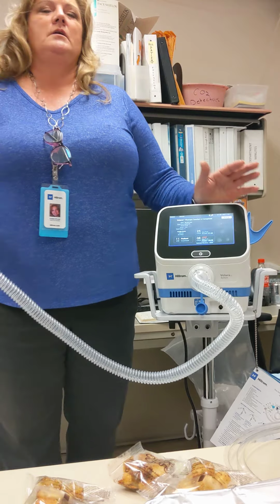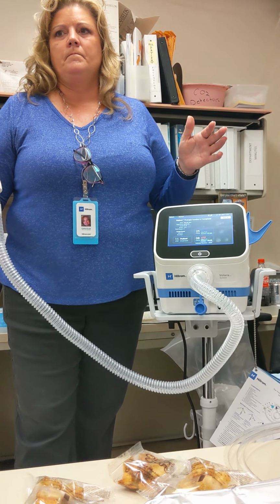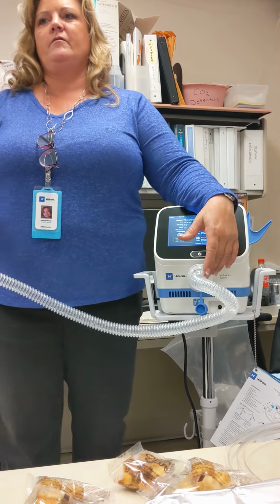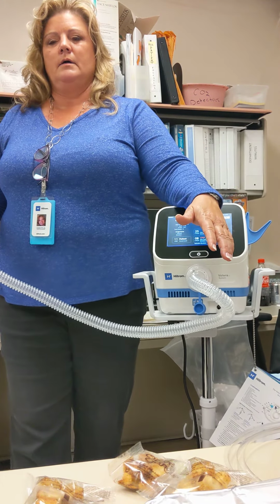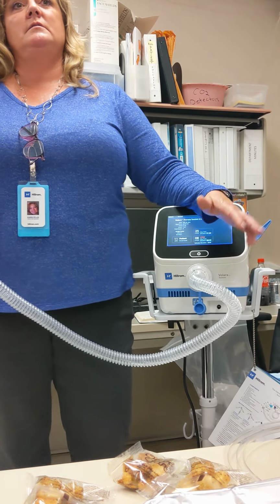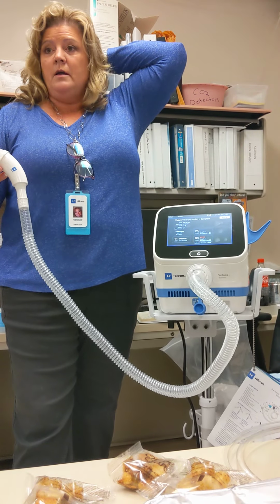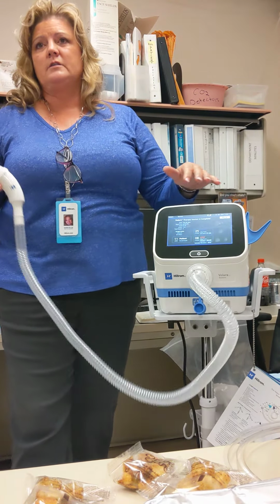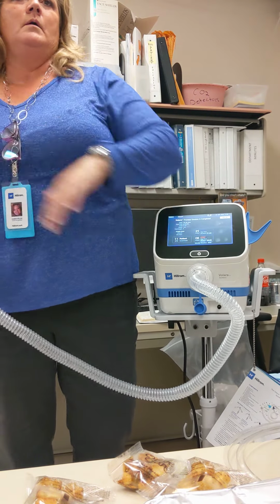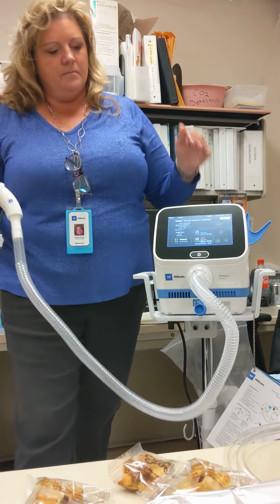CF, Minnesota, do you see CF patients? Rarely, not as much. That's mostly next door. Because they change out a circuit every 3 days. The traditional hospital policy I've seen throughout the 5 states that I cover is 5 days, and they get a new circuit. So you'll never see the 90 treatments, but that's for home. That's the hospital policies that we see around.